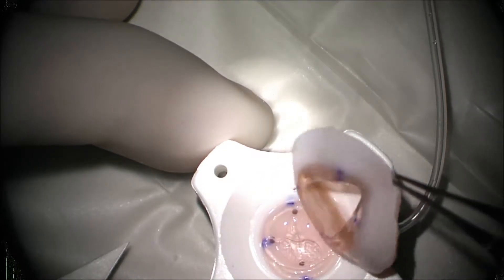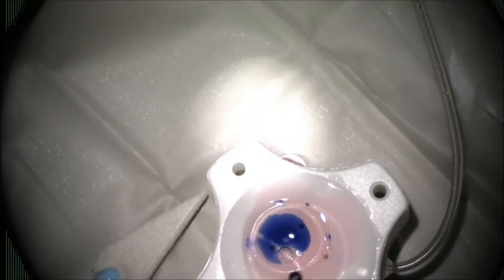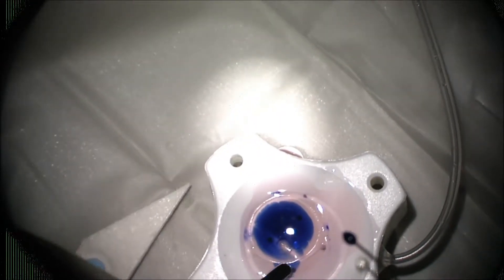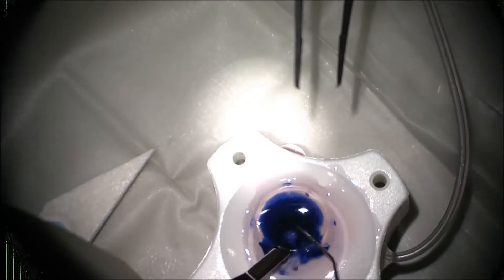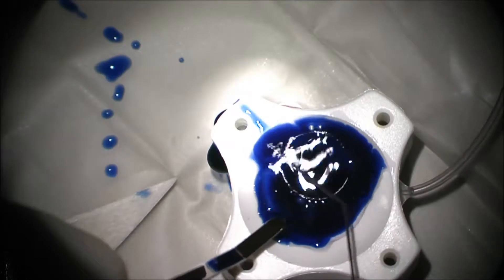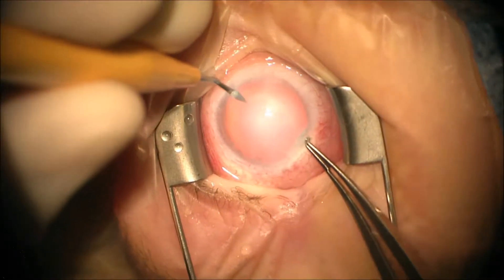Here's the scleral rim that's been removed. The cornea in this patient's eye was very, very hazy, so we decided to stain the graft with TriPan blue — that will help us visualize it once we're in the eye. I stained the endothelium and now I'm putting my probe underneath to stain the stroma as well.